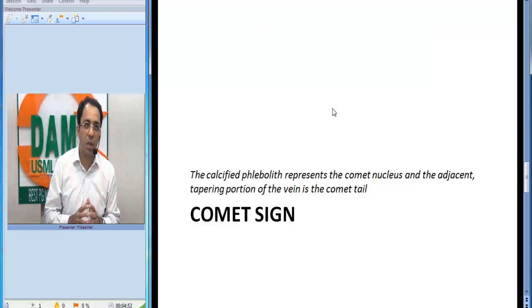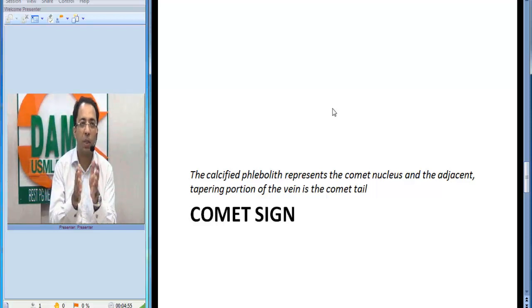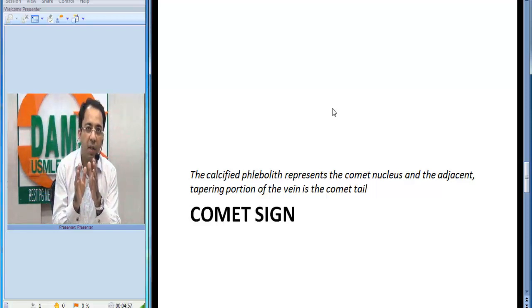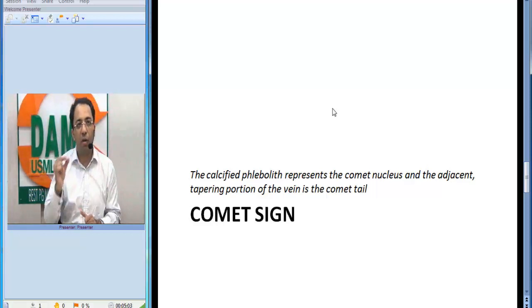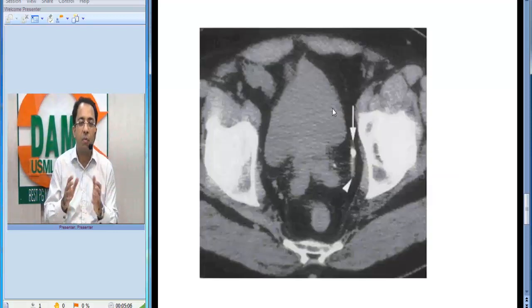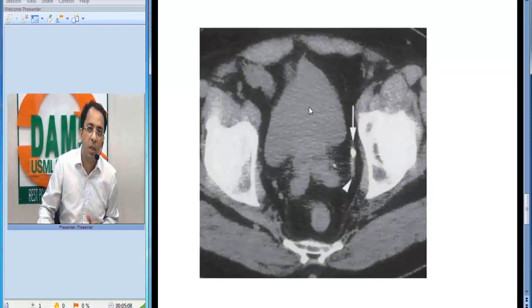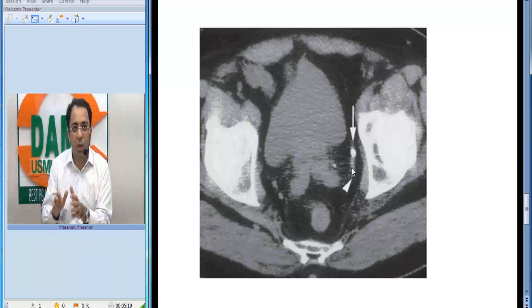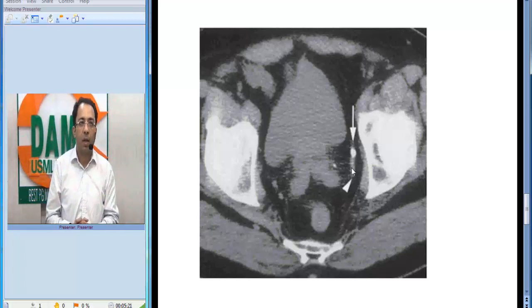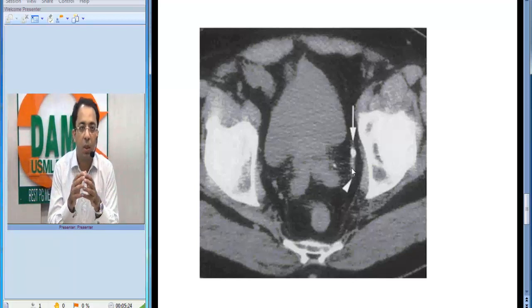The third important sign to learn when posted in emergency and looking for ureteric stones is the comet tail sign. A calcified phleboleth will show a comet sign, where the phleboleth becomes the nucleus of the comet and the vein forms the tail. You can see the bladder here and the phleboleth with the associated comet tail. This comet tail sign represents a phleboleth and helps us differentiate it from a ureteric stone.